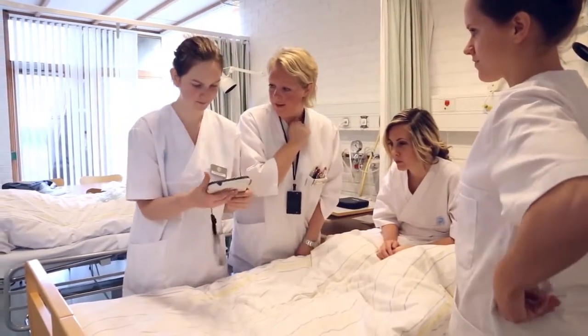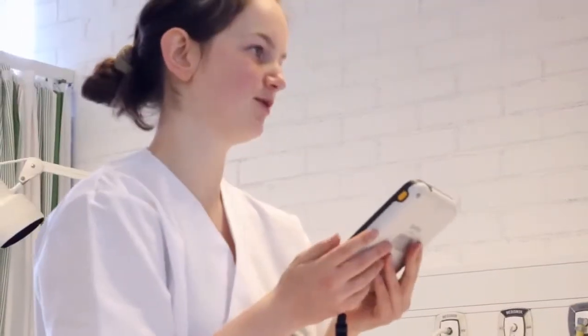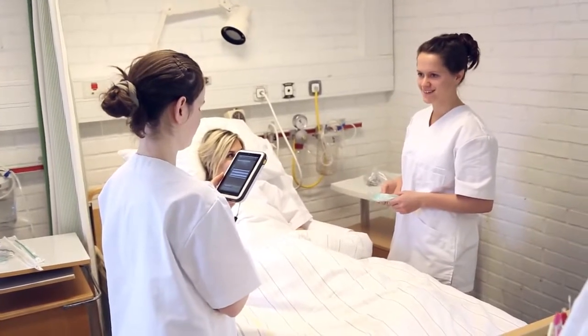What they hadn't done before was to standardize the delivery. So what they did was to take almost like a checklist on the SimPad, and they went through that checklist in a way that allowed for standardization in the training session. And suddenly they found themselves in a position where students could use the SimPad. It wasn't an instructor anymore or a teacher. A student could actually use it with two other students, which is probably one of the really unique features of this implementation.